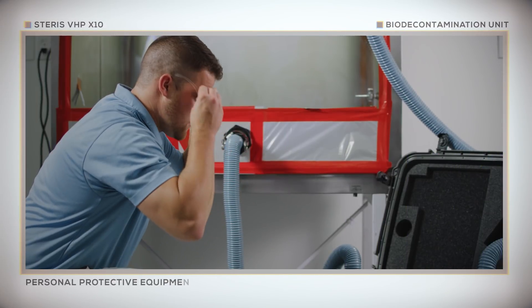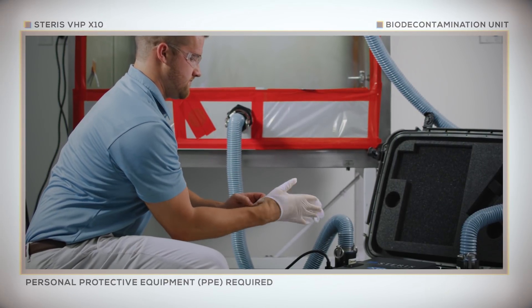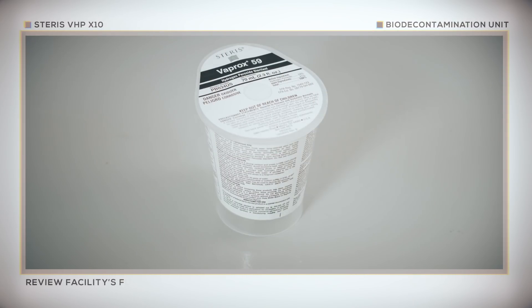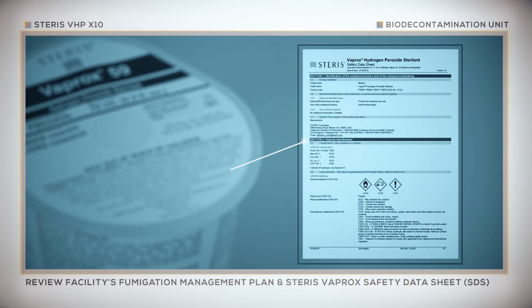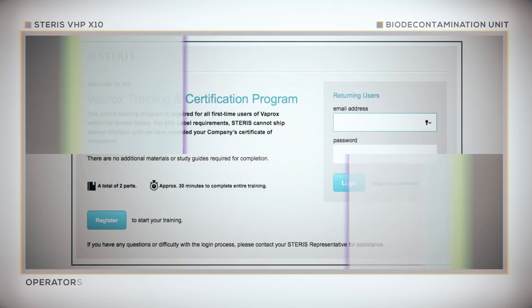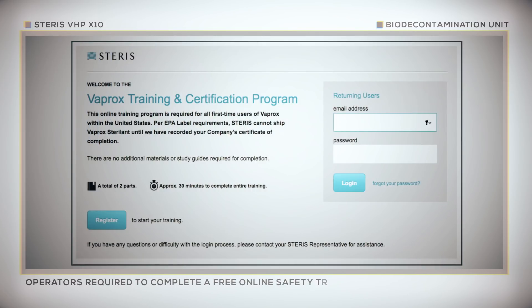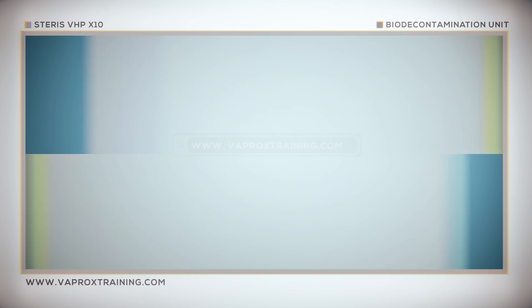Personal protective equipment, or PPE, is required when handling Vaprox hydrogen peroxide sterilant. Before coming in contact with Vaprox product, review the facility's fumigation management plan and the Steris Vaprox Safety Data Sheet. Before using Vaprox, operators are required to complete a free online safety training course offered by Steris. You can sign up for this online course at any time at www.vaproxtraining.com.